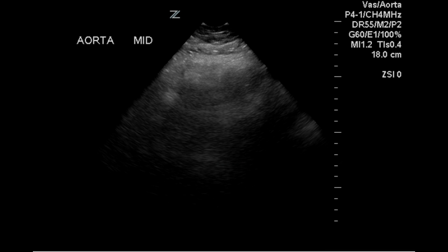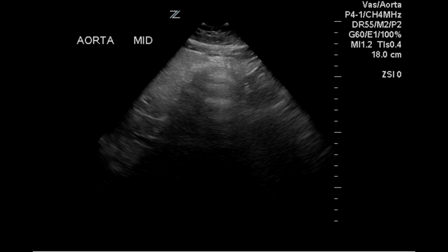The mid portion of the aorta was not visualized in longitudinal imaging due to overlying bowel gas. The same was true for the transverse imaging attempt.